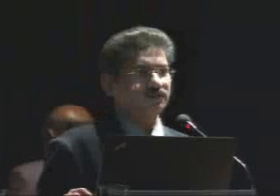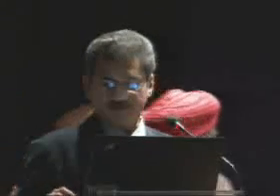for giving me a chance to speak on a very common problem, but very difficult solution at times. I am going to talk about a new technique which is called video-assisted anal fistula treatment. In this technique, there is no cutting involved, there is no post-operative dressings. One is quite comfortable.